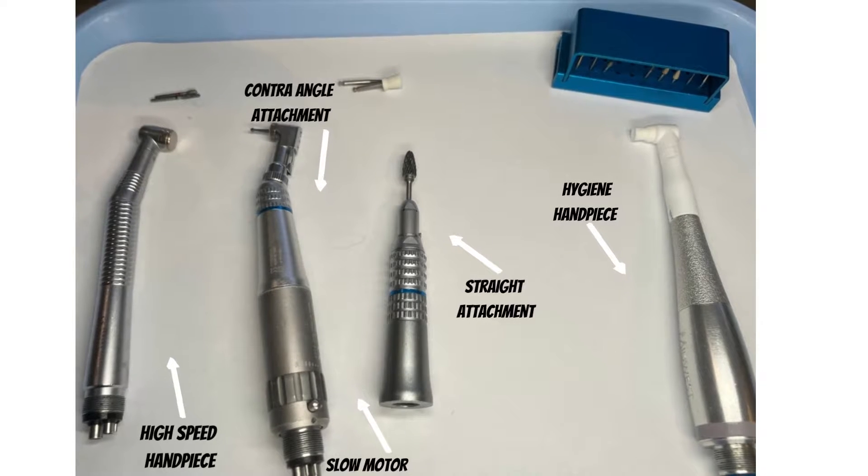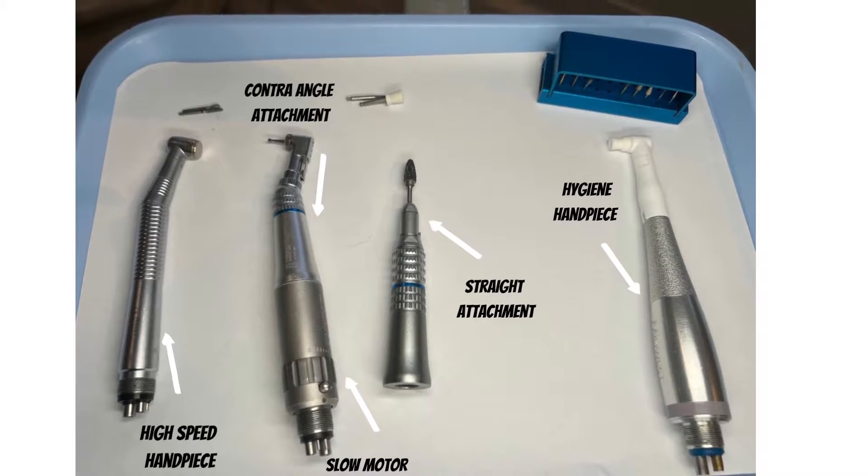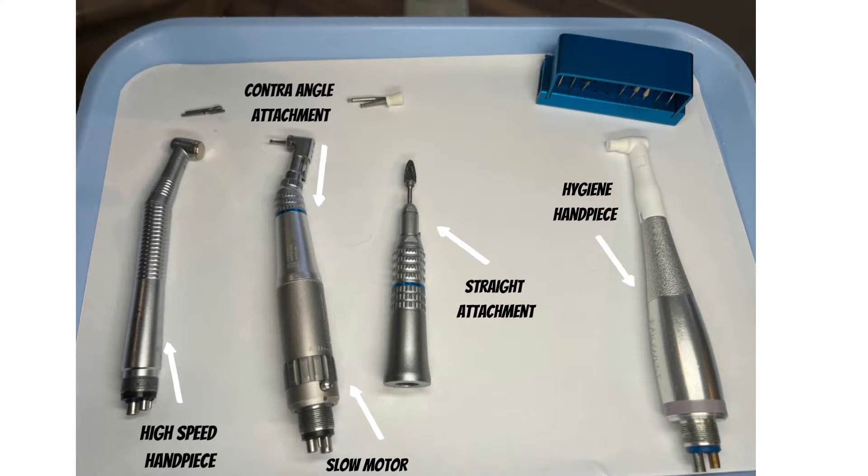In the dental field we have three motors we typically use. The first would be a high-speed handpiece, as well as a slow motor that has two attachments: either a straight angle attachment or a contra angle attachment that goes on to the slow motor, as well as a hygiene handpiece that is typically used for prophy polishing.